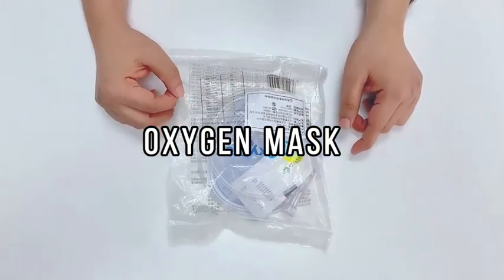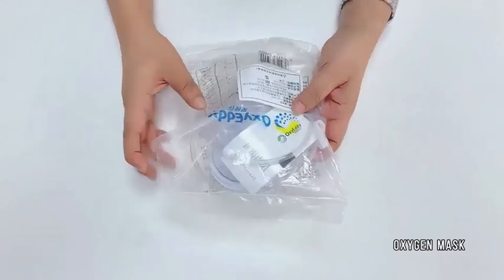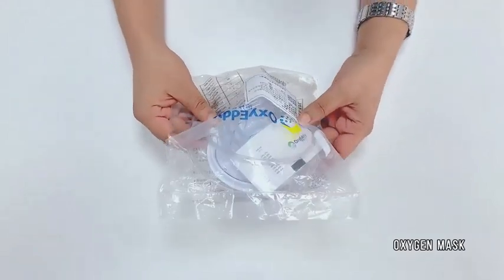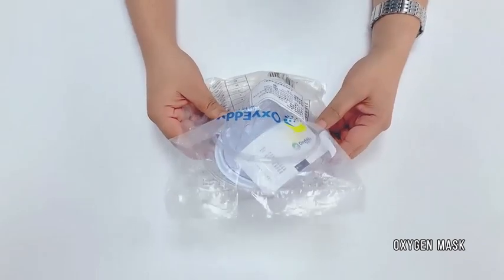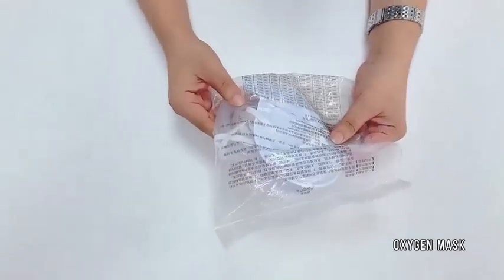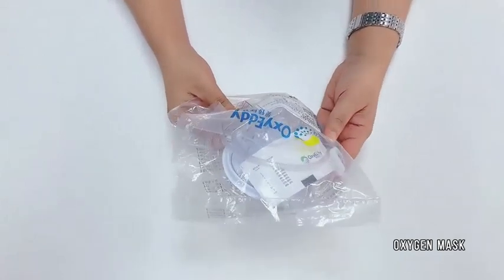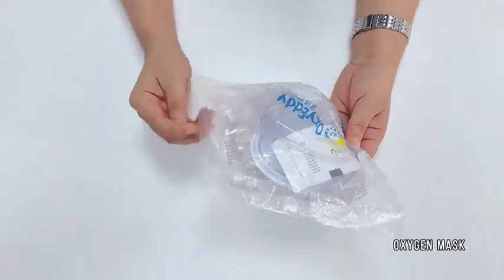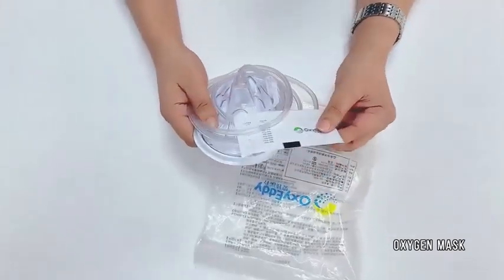Hello viewers, today I'm going to show you one oxygen mask which is called OxyEddy, made by ZHMedic. You can see the package of this OxyEddy mask. Now I'm going to open it.